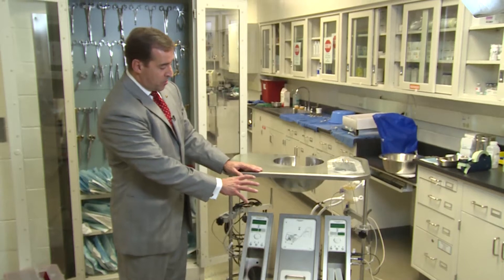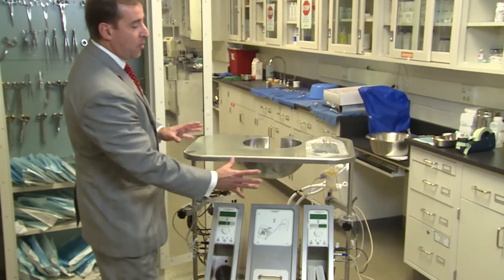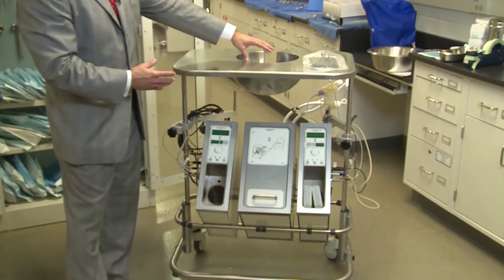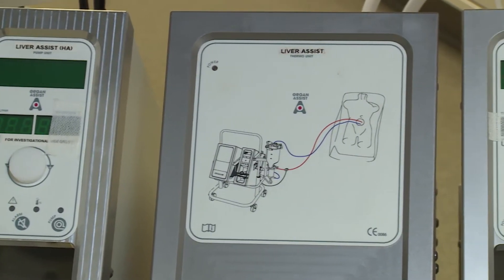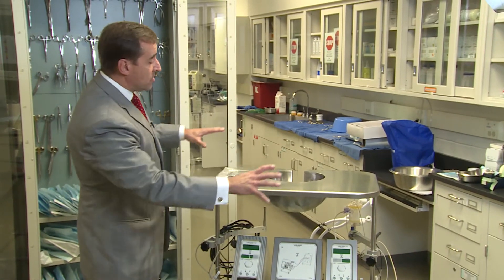This device is built with two different pumps, so each of these pumps will be perfusing fluid through either the portal vein or the hepatic artery, and through the liver that will go inside here. We can control the flow, the temperature, and the pressure, so the organ sitting here is basically a live organ with all the features that you will see inside of the body, but being outside of the body.